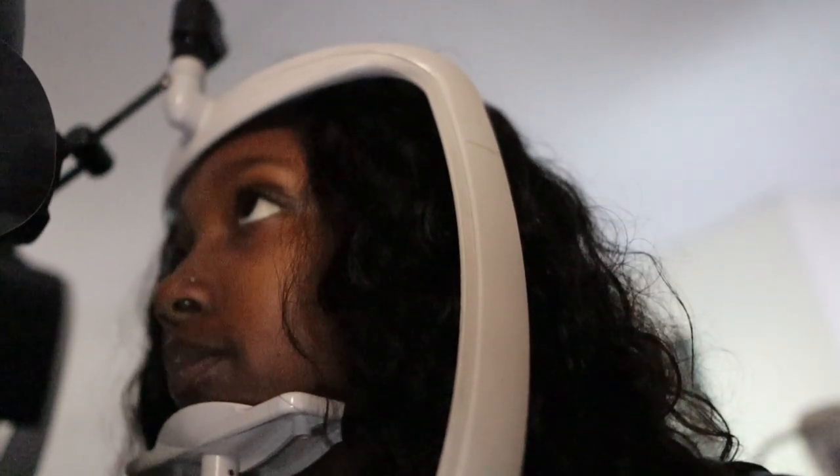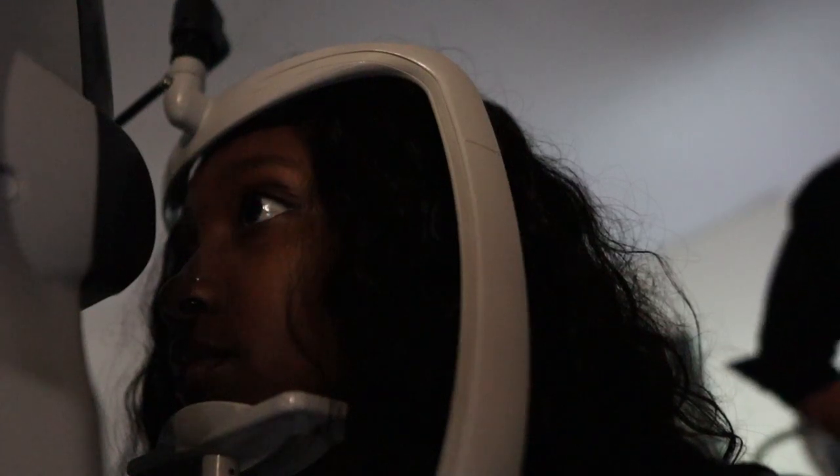Ready? Yes. Alright, so I'm going to scan the back of your eyes, as I said. Cool. So you see a green cross inside the machine. I need you to focus at the center of the cross. You see it just now? No problem. Okay, perfect. Let's follow the cross. Yeah, all done. You can have a seat in the waiting area for now. Do you have a driver with you today? Yes. Please blink and then open as wide as possible. Don't blink, don't blink, don't blink, you can blink.